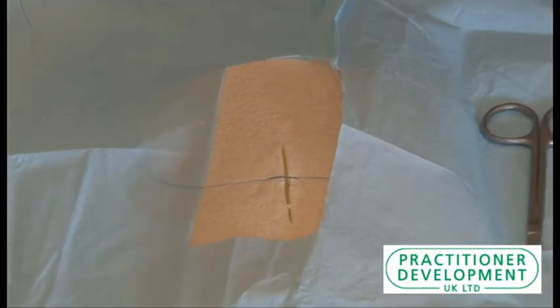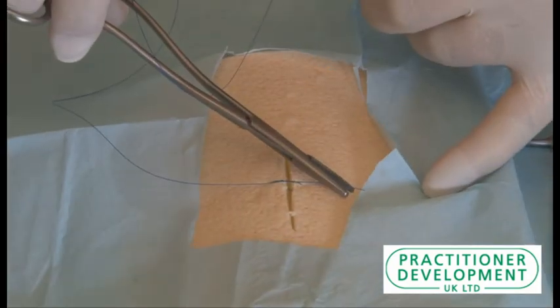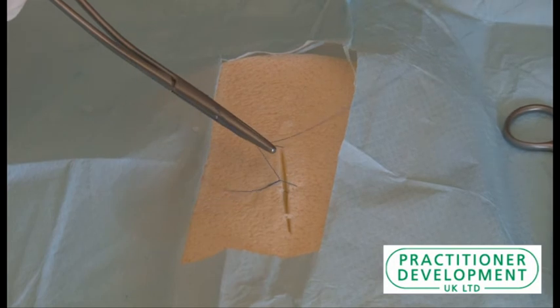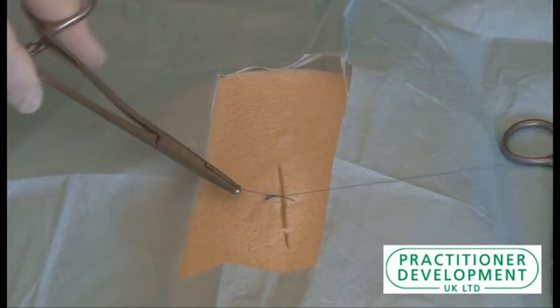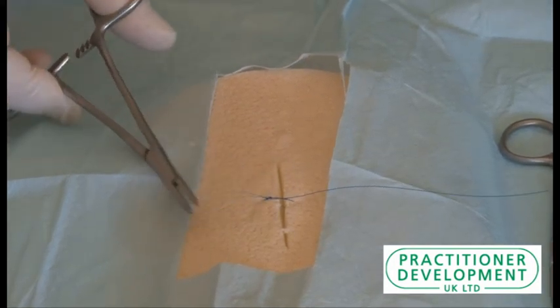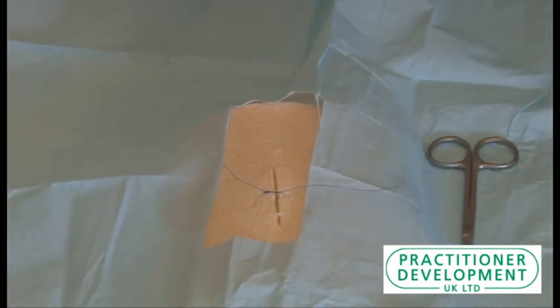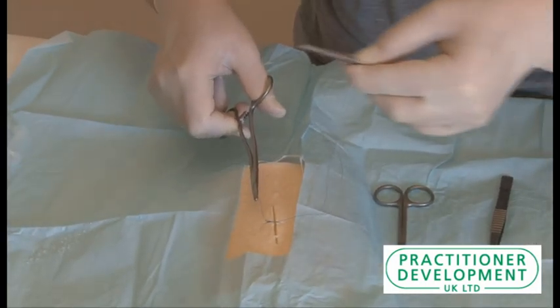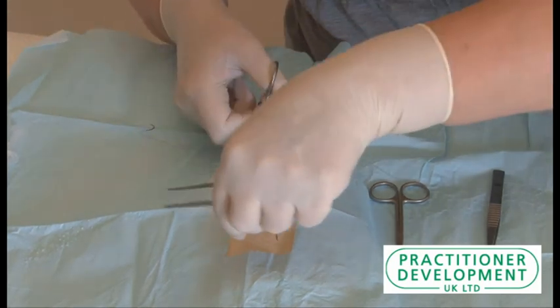And the last one, once round again, grab the end and pull. We're then going to trim, and that is your interrupted suture which has been put into the middle of the wound.